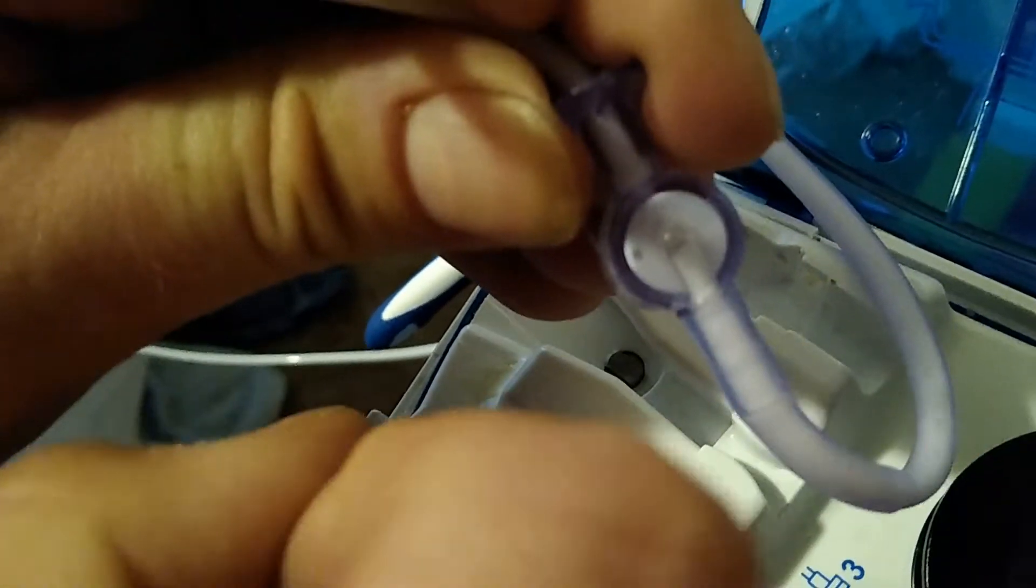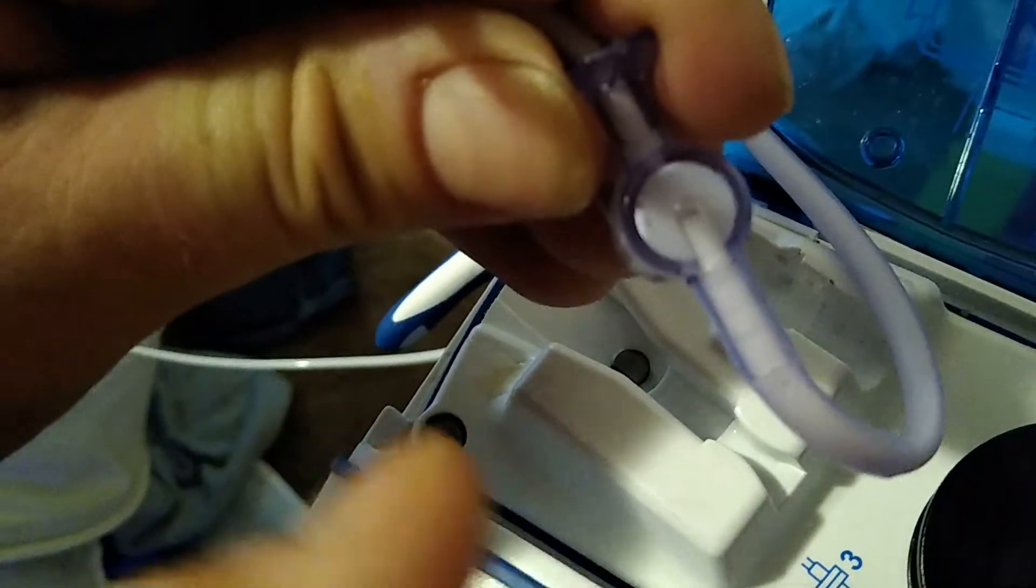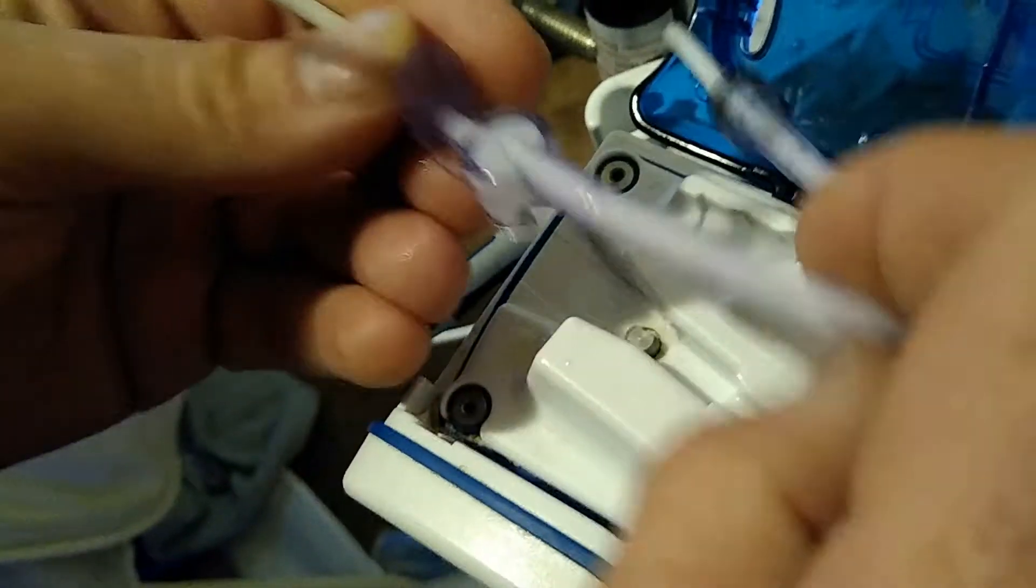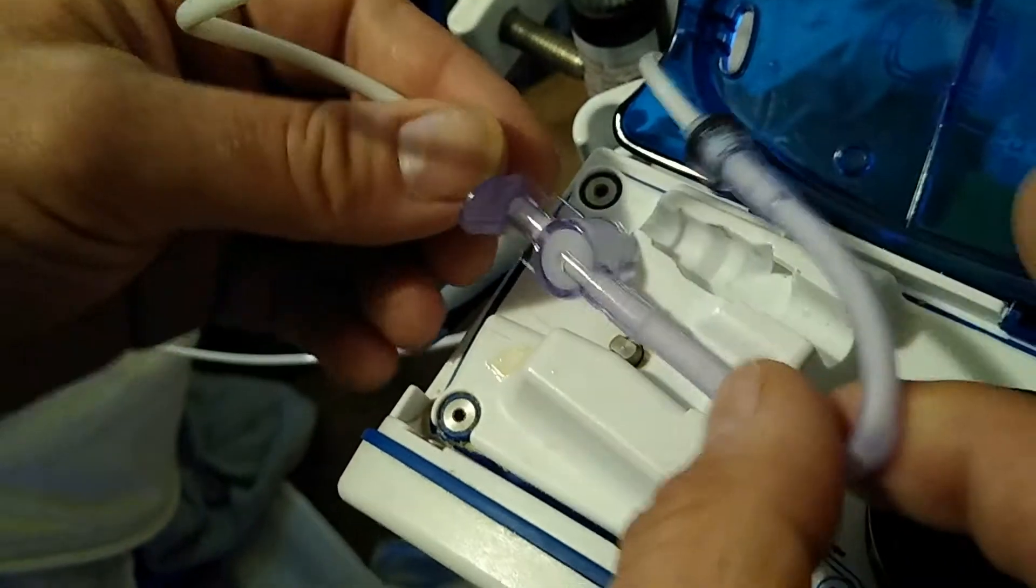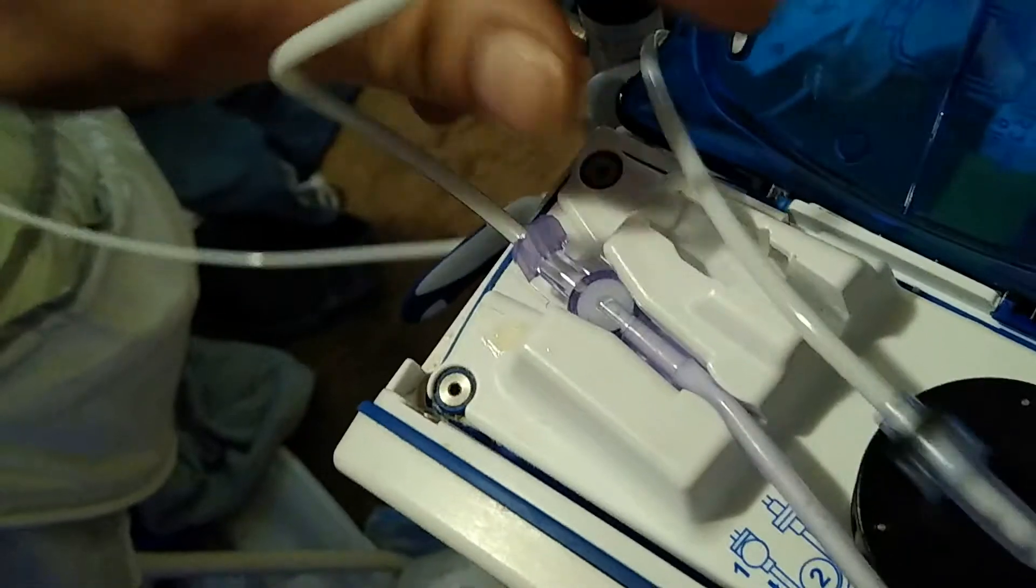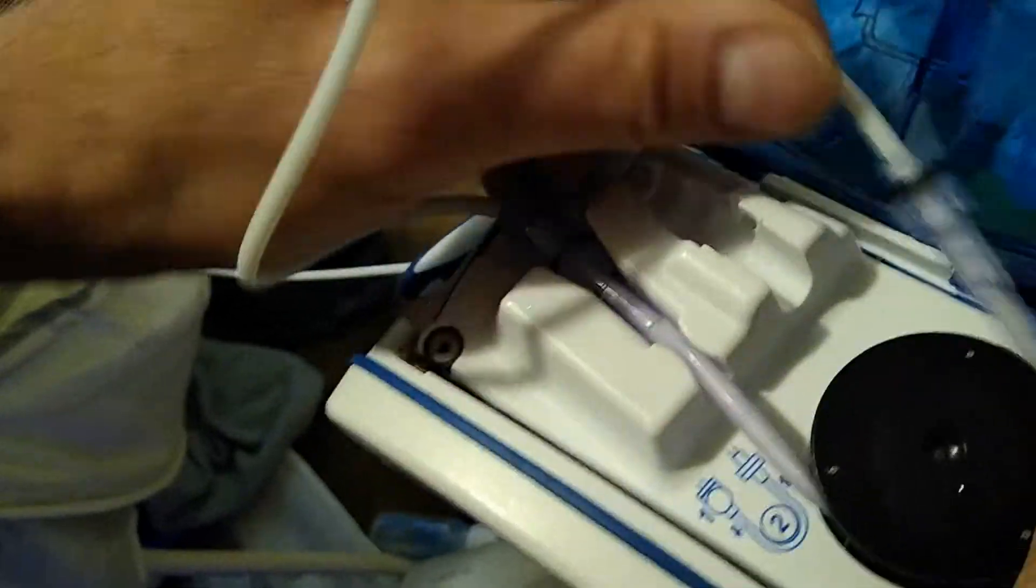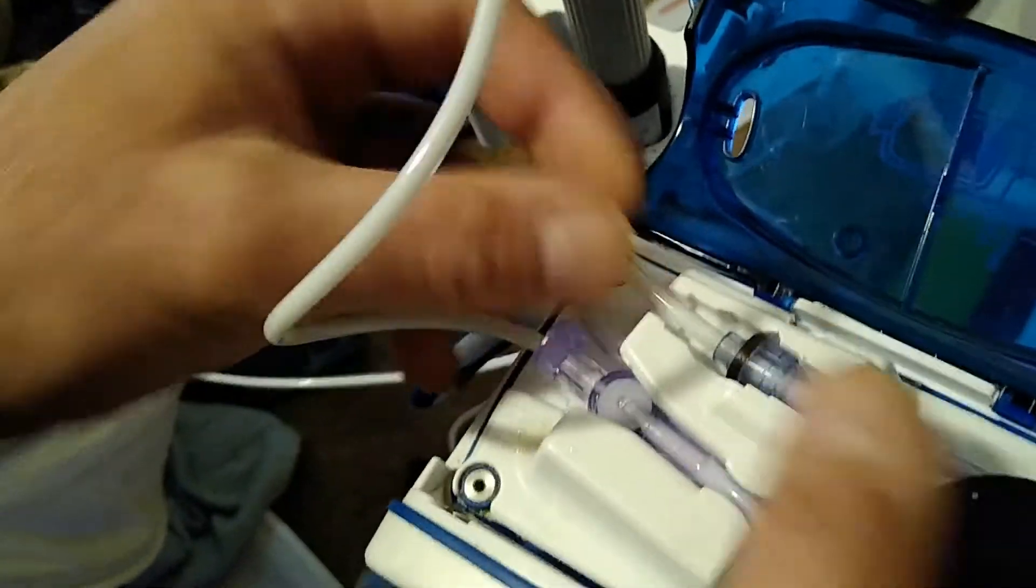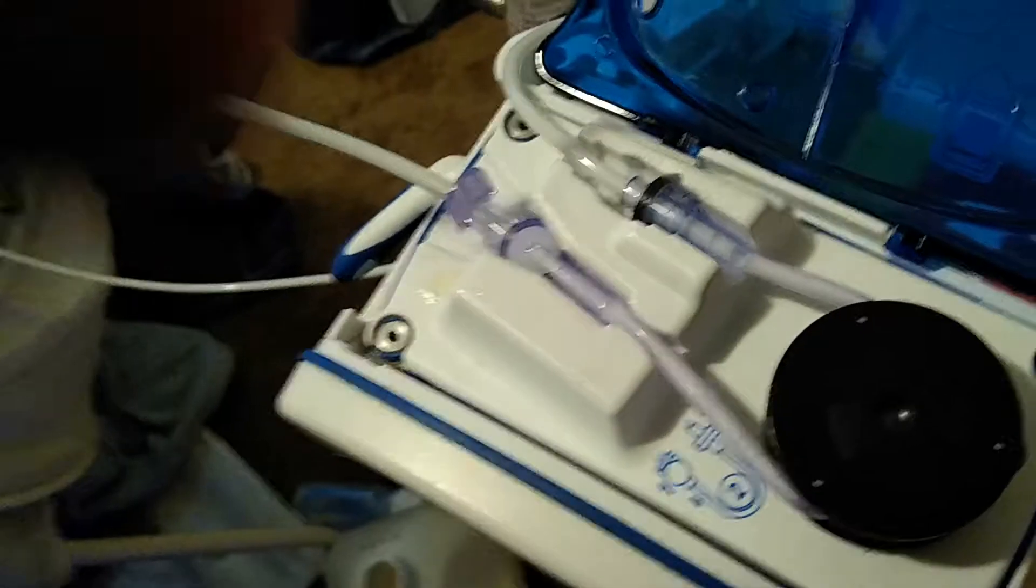So you can flick it a few times. Now to prevent that from happening at all, what you can do is before you put your formula in, let it sit in the bottle for about a minute so there's no foam at all.